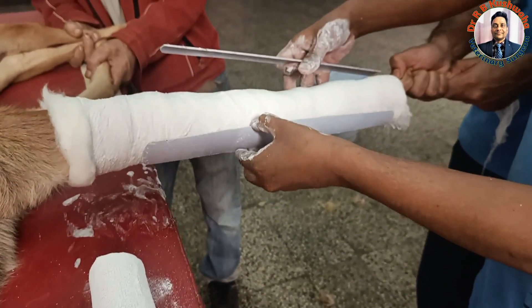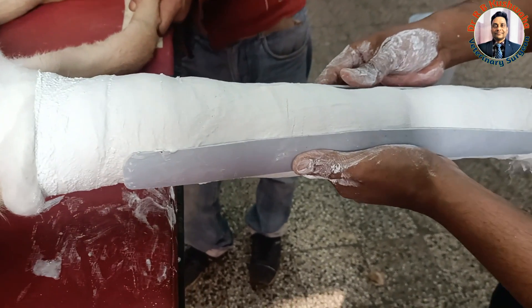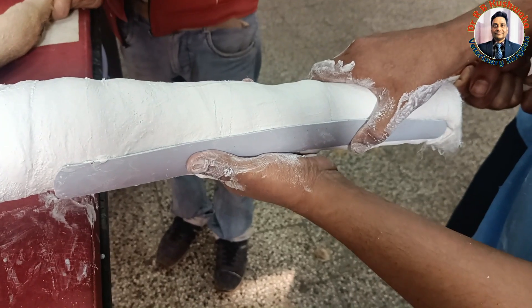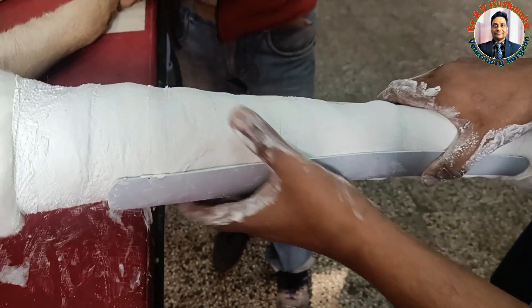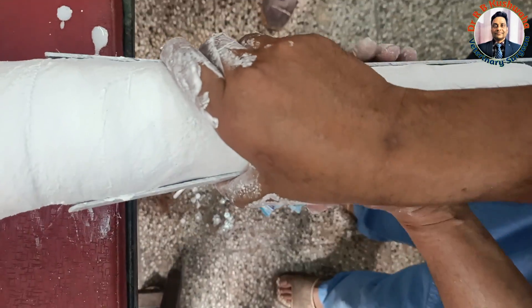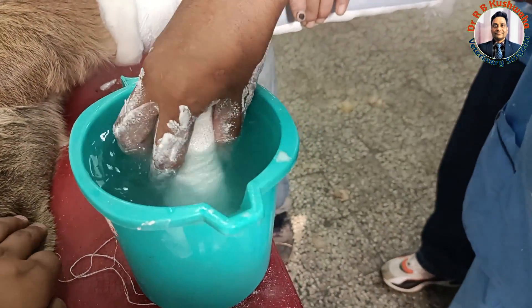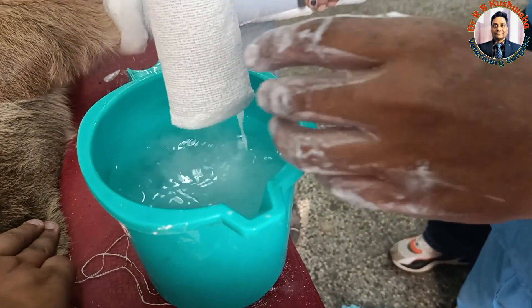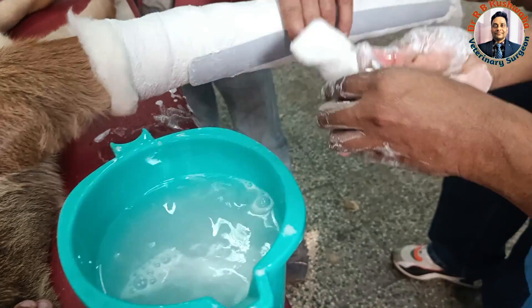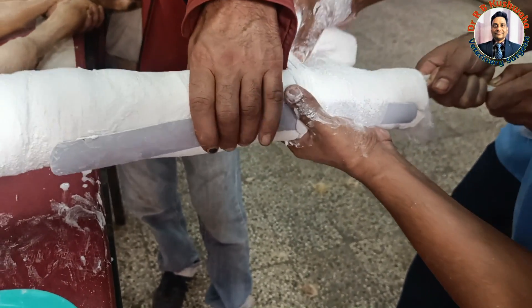Now the splint is applied. Normally splint is applied at right angles, but here I apply it differently. Otherwise I would need three splints — one at the anterior surface, one at the posterior surface, and one medial. Since the animal is light in weight, only about 25 to 30 kg, this approach works. The advantage of incorporating the splint between layers of plaster of Paris is that it does not cause any injury to the skin. I will again start from the distal side.